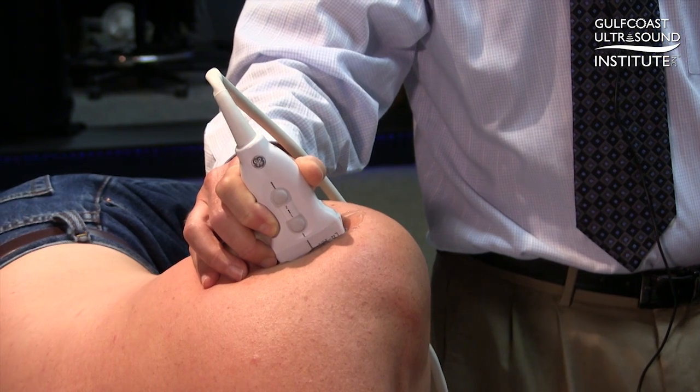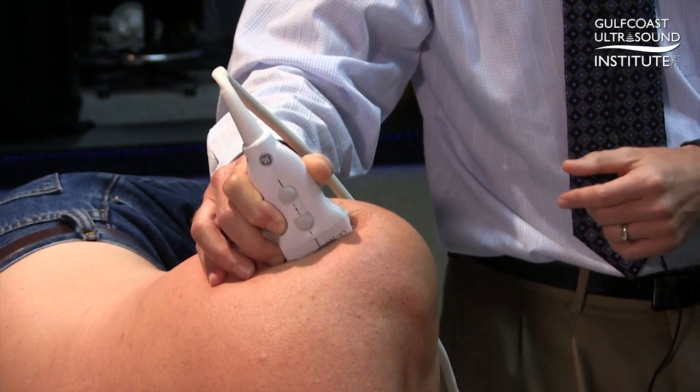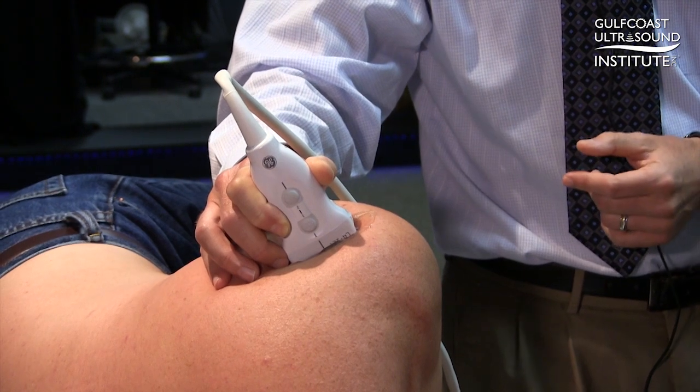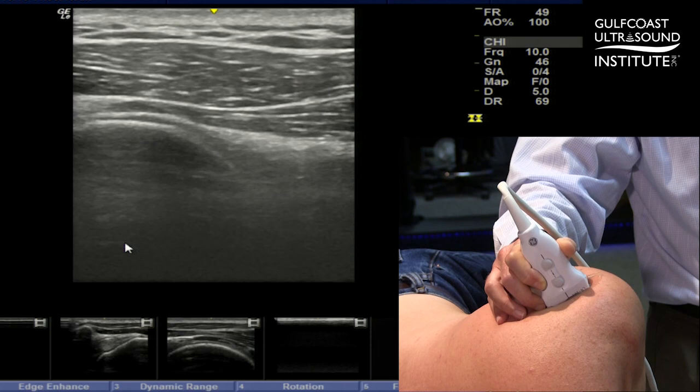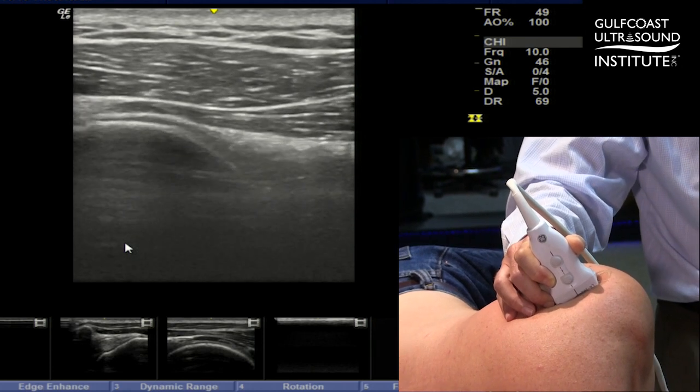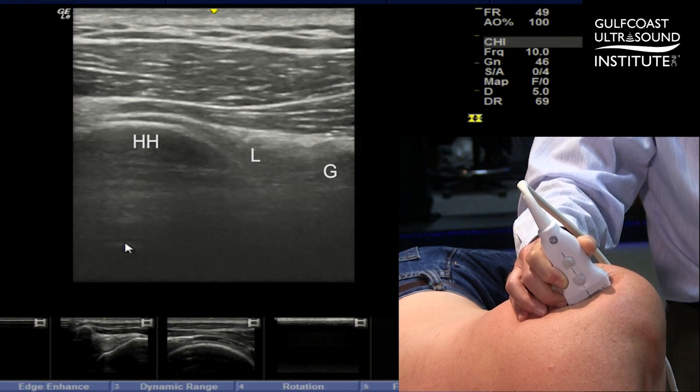So basically what you want to do is your typical setup for a glenohumeral joint — you're going to have a short axis view of the posterior aspect of the glenohumeral joint. We have Greg here in a side-lying position just for comfort, and we're getting a sonographic image of the posterior glenohumeral joint. The relevant anatomy is obviously the humeral head, the labrum, and the glenoid.